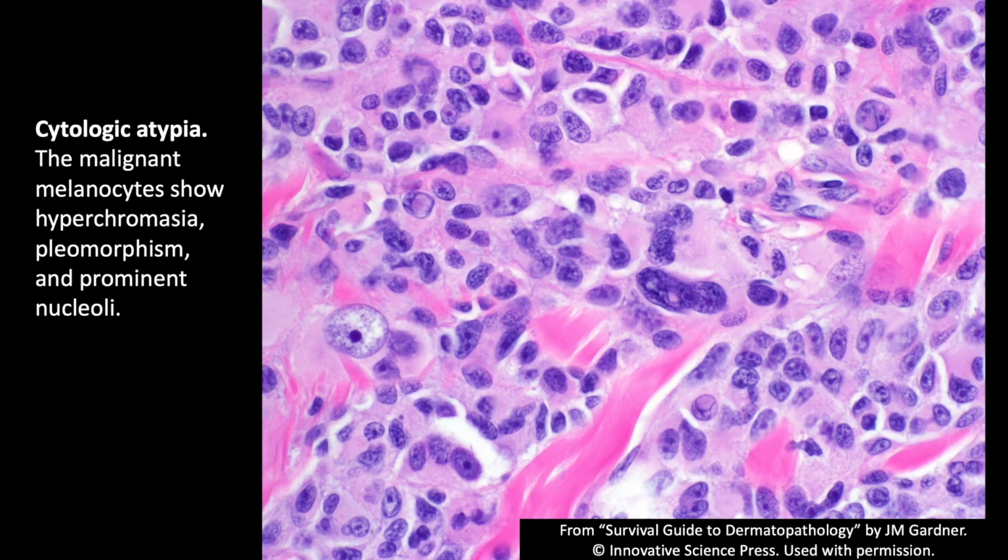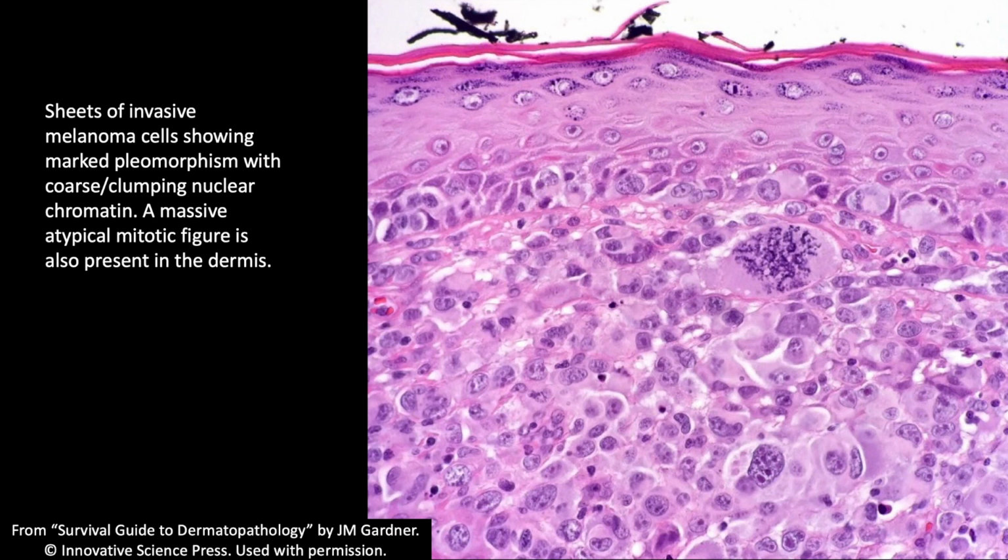And of course, you all know how to look for pleomorphism and atypia and mitotic activity. Like, look, you don't usually find these huge, massive atypical mitoses in a melanoma. This was a massive nodular melanoma, if I recall correctly. And I mean, you could karyotype that. There's like 530 chromosomes in that melanocyte there. So, but if we see mitoses, particularly if there's many mitoses, deep mitoses in the deep dermal aspect of the lesion, or atypical mitotic figures, those are all bad, concerning signs for melanoma.